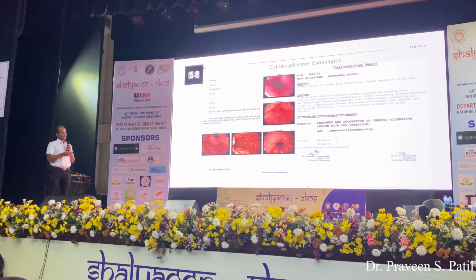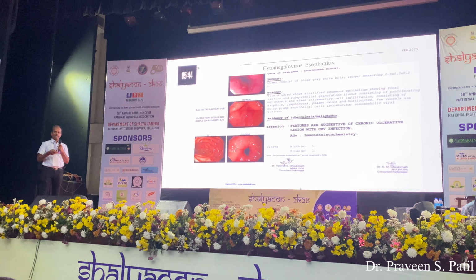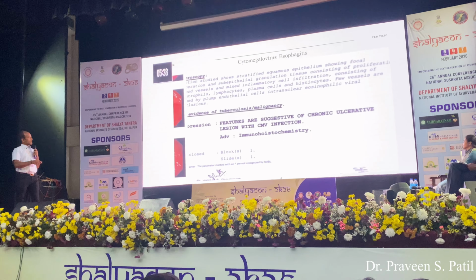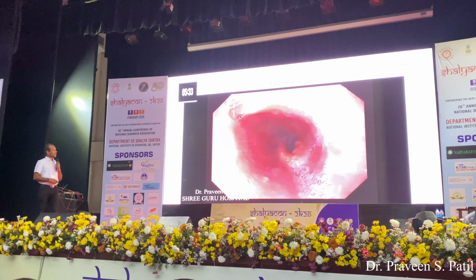This patient came with a history of fever 2 days back, and now he is afebrile, but has sudden onset of severe Hrutkanta Daha. It has been proven with histopathology.